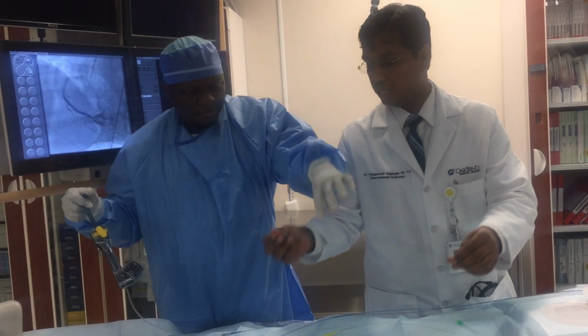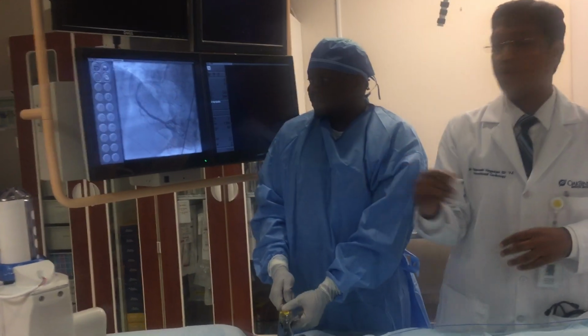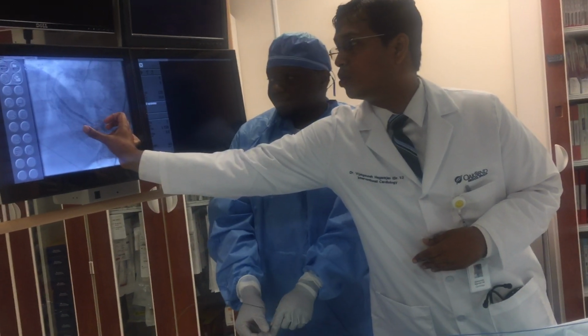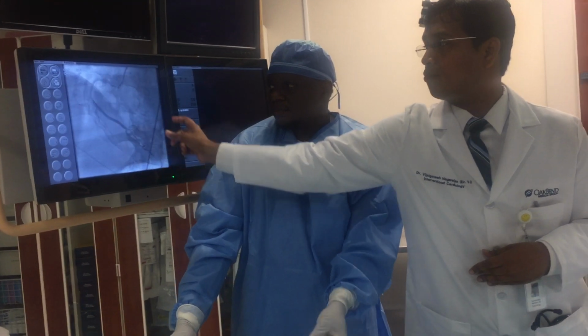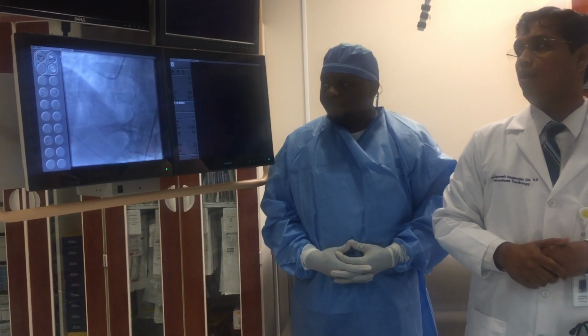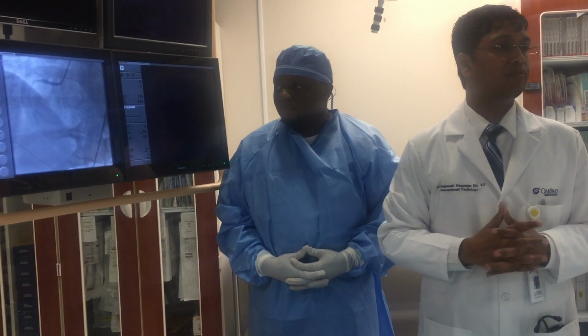So this is what we did to our patient, and this is the final result. You could see the artery was blocked here. There was no blood flow to this whole part of the heart. Once you open it up with the stent, there is good blood flow to all of this heart. So that's the heart attack solved, or there could have been minimal damage to heart muscles, but we opened it up.